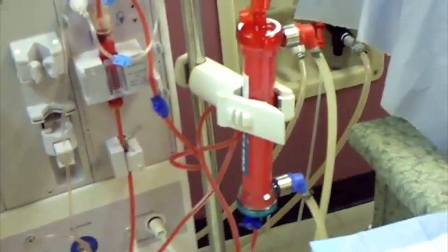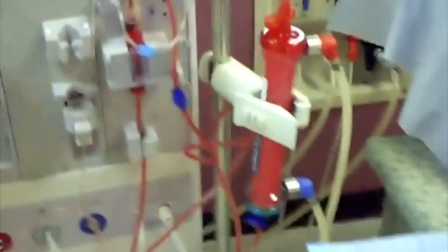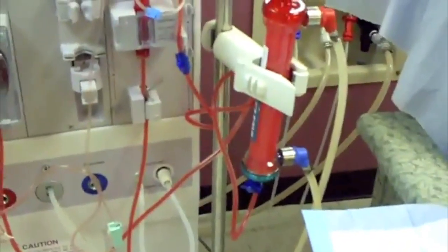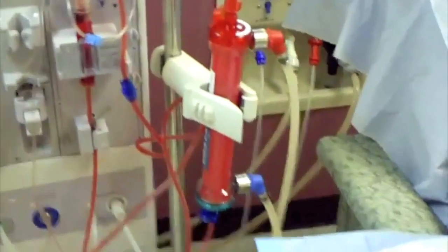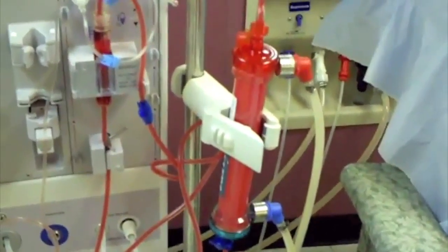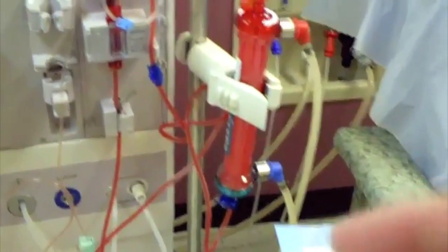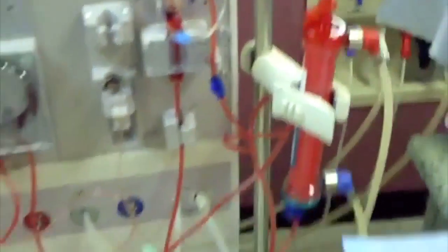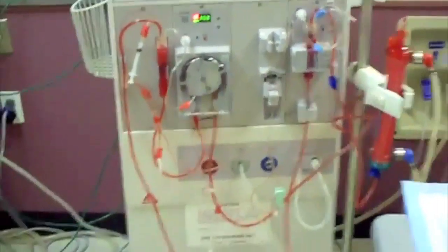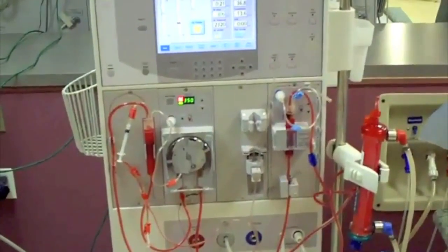And ladies and gentlemen, that is hemodialysis in simple terms. So we have the dialyzer, which acts like the kidney. The blood lines act like the blood vessels in your body. The blood pump acts like the heart that pumps blood to the kidney to remove all the waste product, and the ureter funnels the waste product towards the urethra, which is the hose in the back towards the drainage.